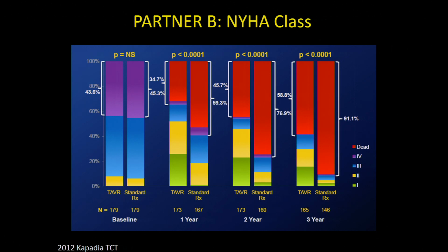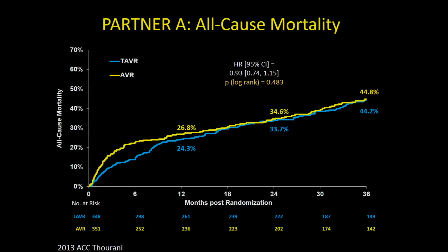So also very encouraging to know that this was not just an interesting concept, but something that actually saved lives and helped people feel better. The other branch of this landmark study was looking at what about TAVR compared to surgical valve replacement? It works pretty well compared to just doing nothing and watching the patients die, but how does it compare to traditional surgery? And in this study and in multiple other studies, it basically worked pretty darn well comparatively.